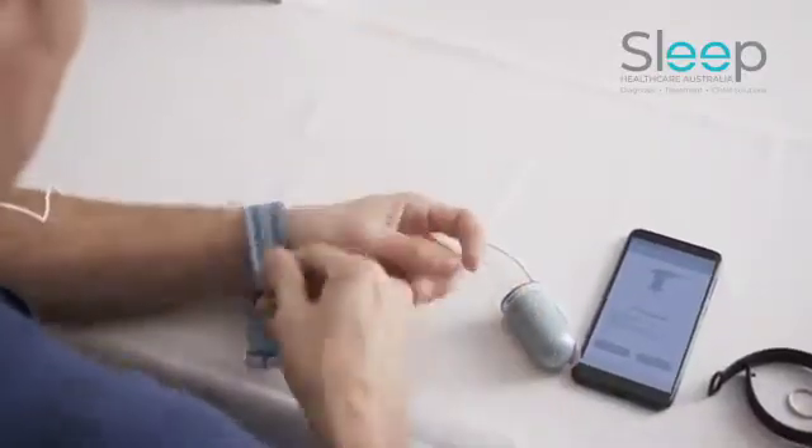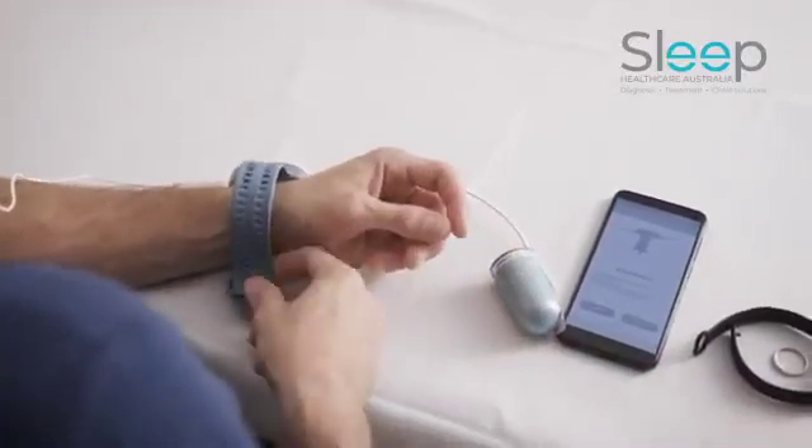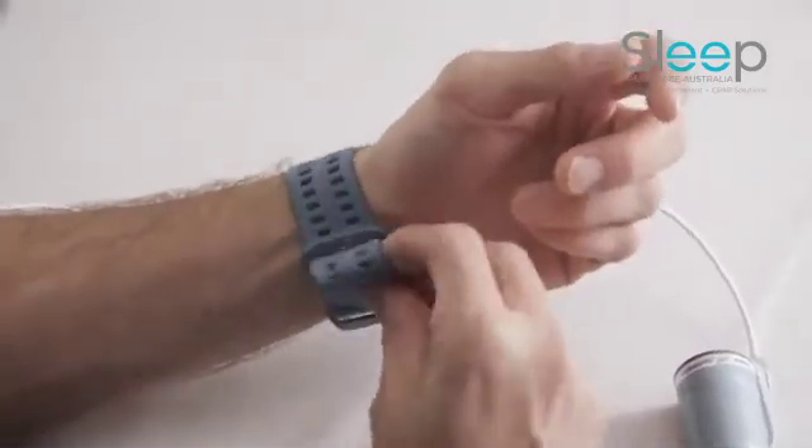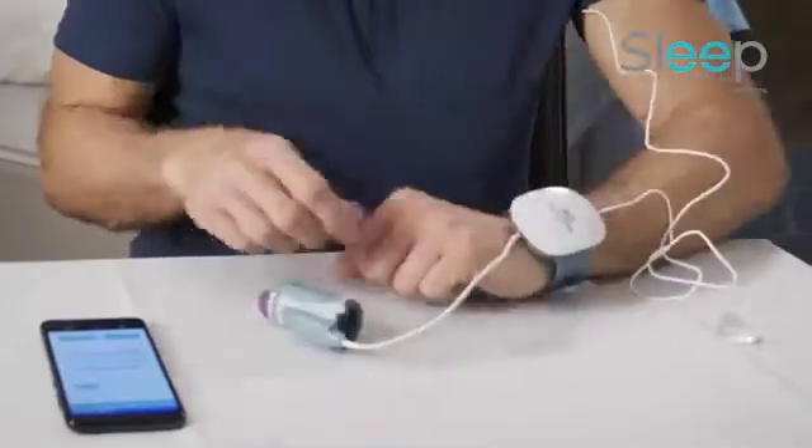Then take the wrist device and strap it on your non-dominant hand — not too tight, not too loose. And press next.